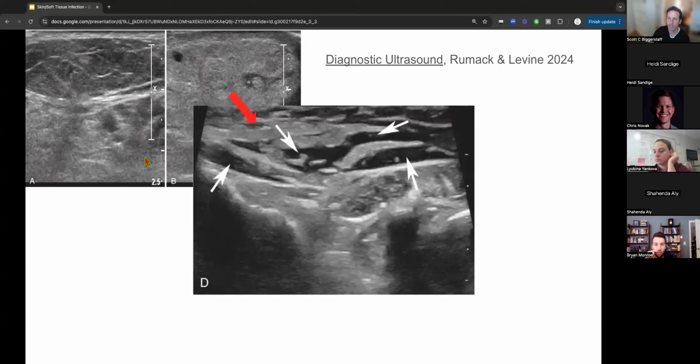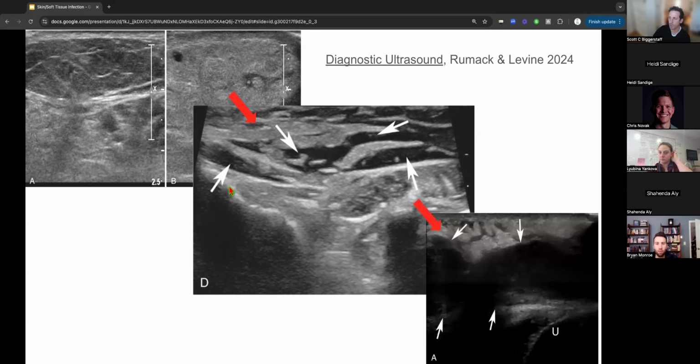The next step generally is that tissue disarray or that cobblestoning appearance where you get edema separating out those fat globules. And if that's allowed to progress far enough, sometimes it forms this abscess where you have this really discrete appearance of an anechoic signal within that subcutaneous tissue. The other things that you can look for, these arrows, I think, are pointing to that posterior acoustic enhancement. And then when you compress that area that you suspect is an abscess, you might identify that swirl sign.